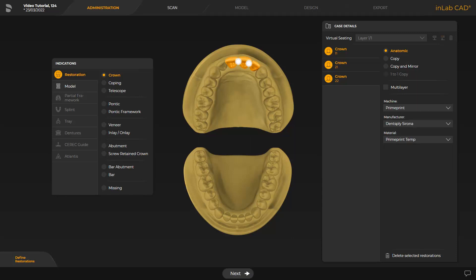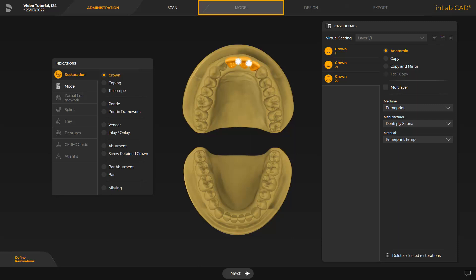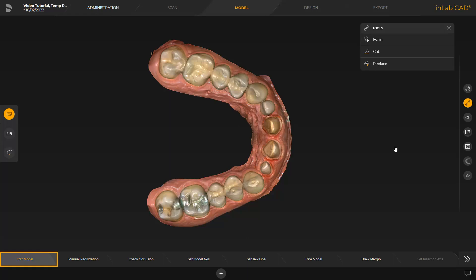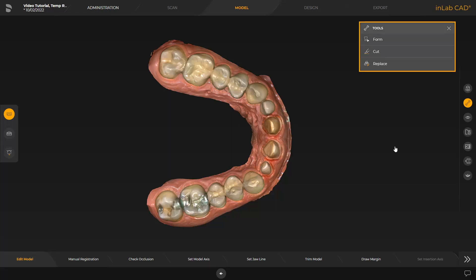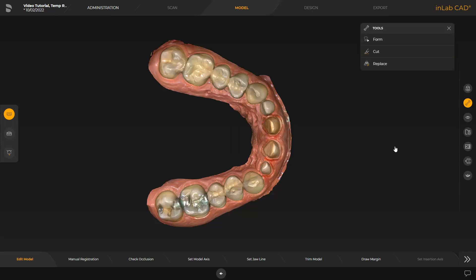All other selections are performed automatically and we could switch to the next phase, the Scan phase. Since these are intraoral scan data, we proceed directly with the Model phase. Inside the Edit Model step, we could edit the model data with the different tools, if desired. In our case, we proceed with the Set Model Axis step.